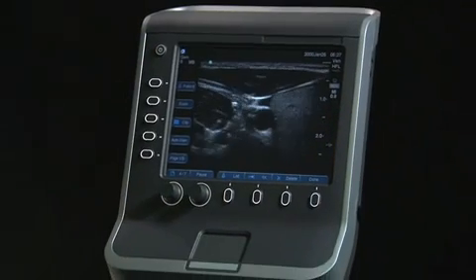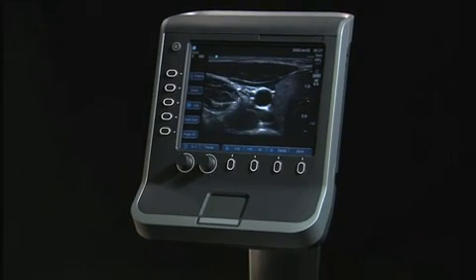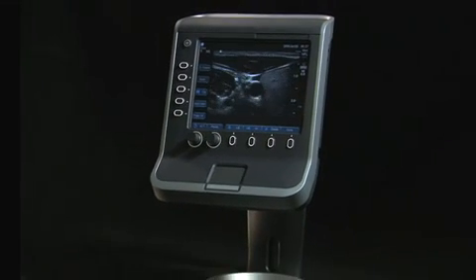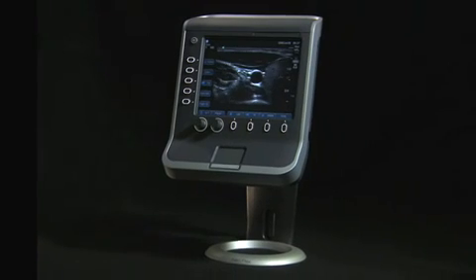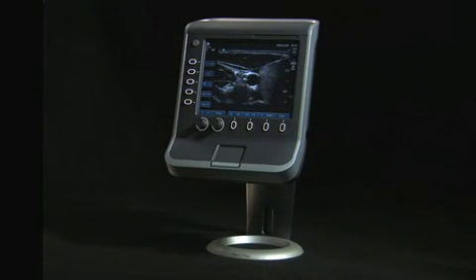This completes the overview on the system control panel and screen layout. Now that you are finished with the overview of the system and controls, you are ready to scan. Thanks for listening.